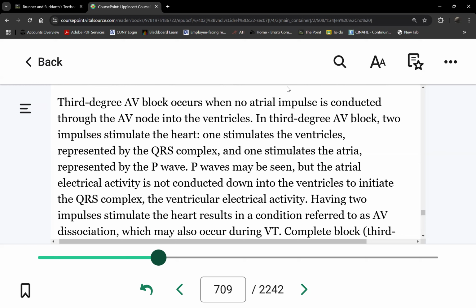You remember the defibrillator we showed you last week? That defibrillator is also a pacemaker. Put the pads on the patient, turn the pacemaker function on, select the rate you want, and the patient will have a temporary pacemaker. Understand? Then in the morning we'll take the patient to the OR and insert a pacemaker. So there's no need to call anybody in, because we have an emergency temporary pacemaker.